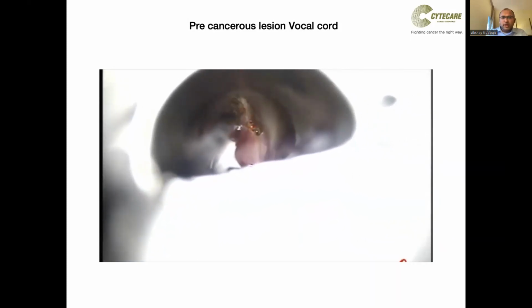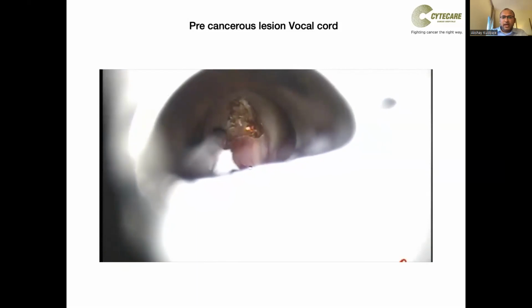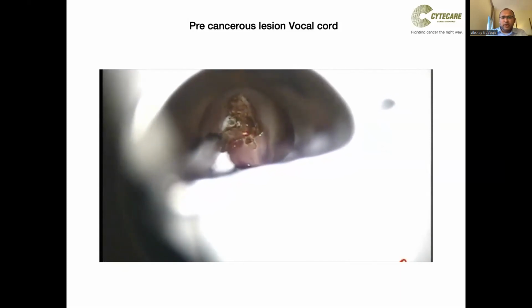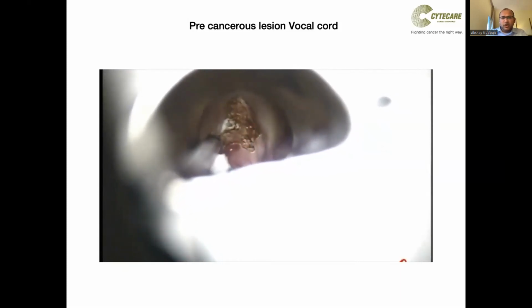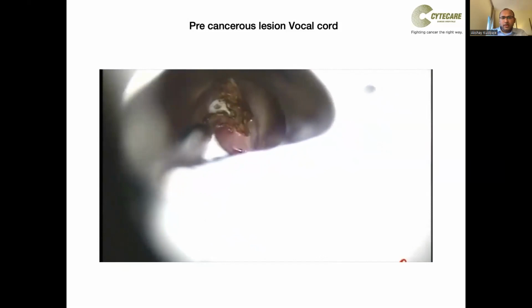Laser being a very precise cutting tool with a focused beam, there is minimal collateral damage and minimal charring. As a result, the functional recovery is excellent. These patients are done as a daycare procedure without any need for an overnight stay in the hospital. As a result, the acceptance as well as the recovery of these are very good.